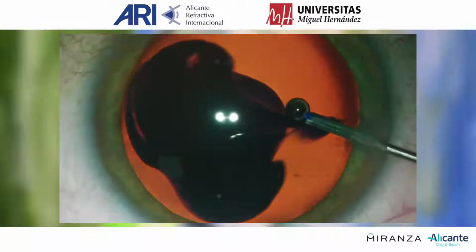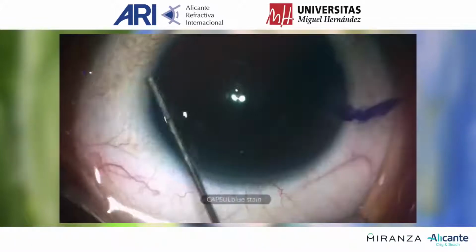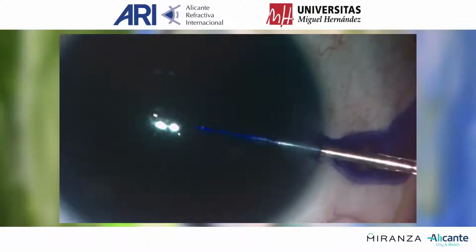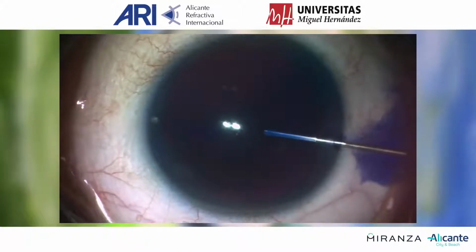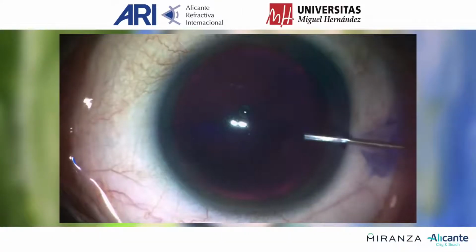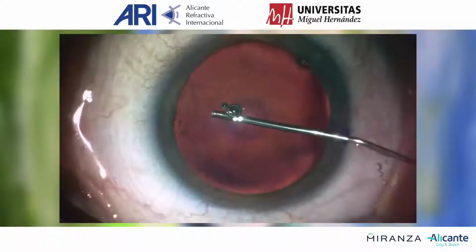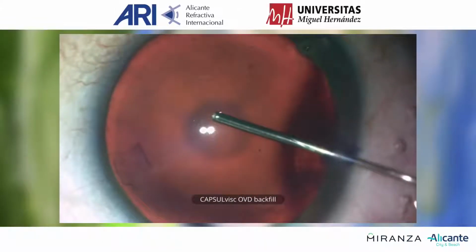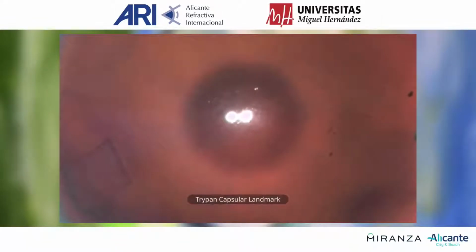The procedure begins with anterior capsule staining with proprietary trypan blue for 30 seconds. The dye is washed out by BSS or Ringer solution, and the anterior chamber is filled with OVD. The blue center is a landmark for capsulotomy centration.